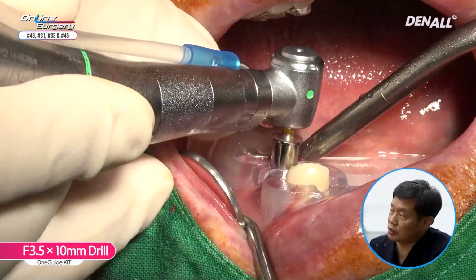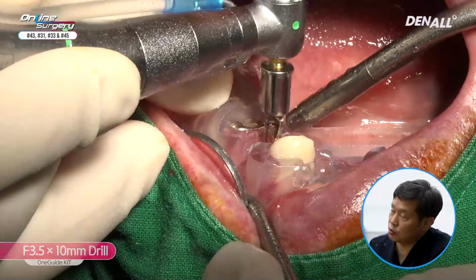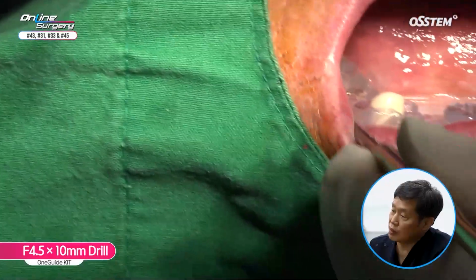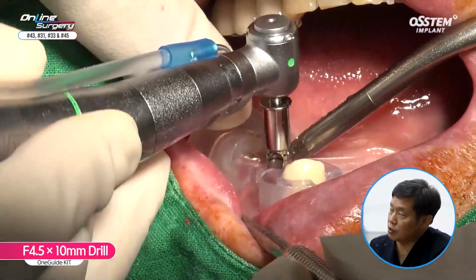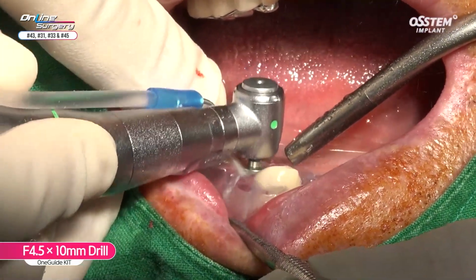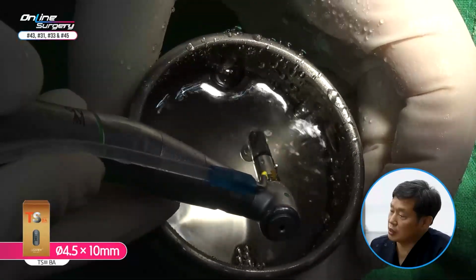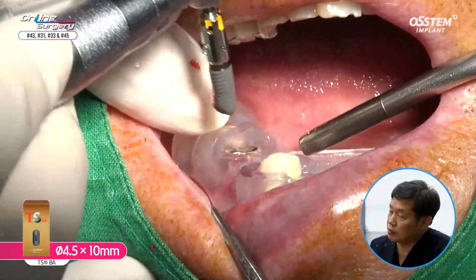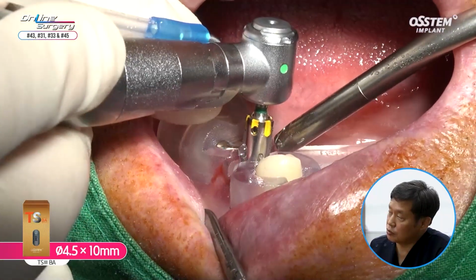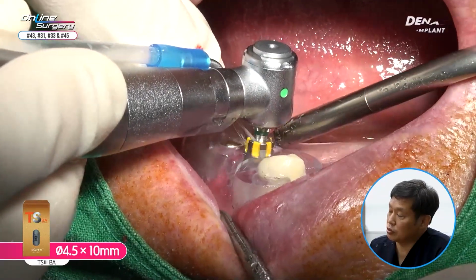3.5 by 10mm drilling was done. When placing an extraction socket, there can be slipping. Next is 4.5 by 10mm OneGuide drill. TS3 4.5 by 10mm implant was placed. Implant was positioned with irrigation. It was placed about 70-80%.